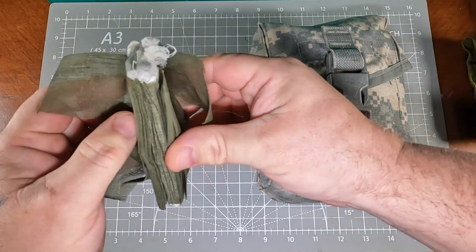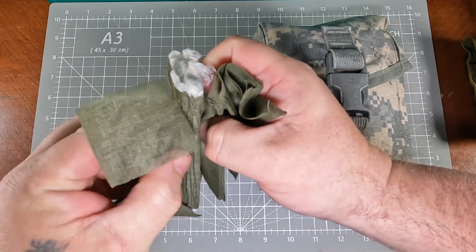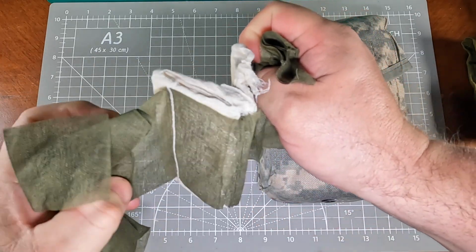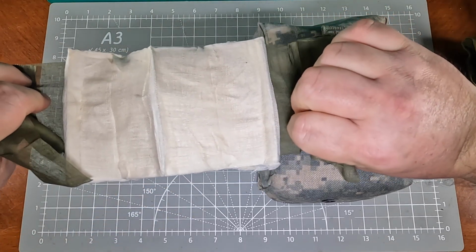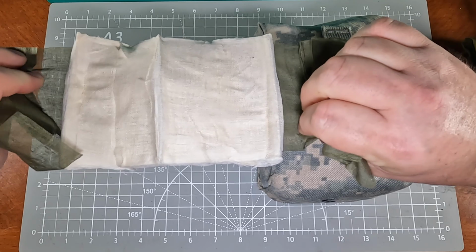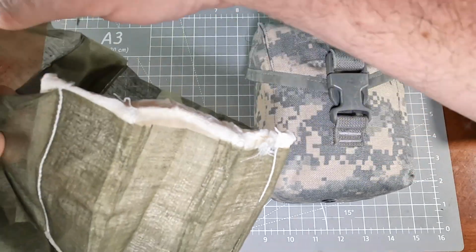And you'd grab it by the ends. The inside part would be sterile. And then you just kind of ended up popping it open so that you could put it on the wound, basically holding it by the ends. And inside the gauze expands, and you end up getting kind of like a 4x7 type gauze. And that would basically be put on the wound. And then you take the ends and wrap it around.